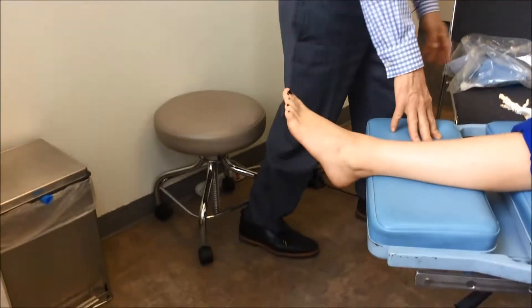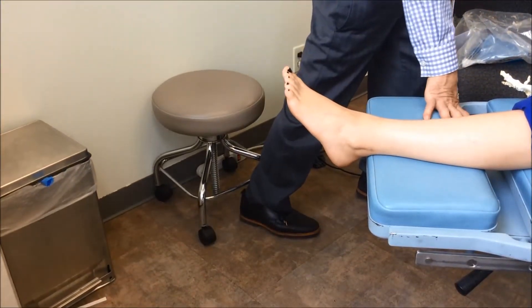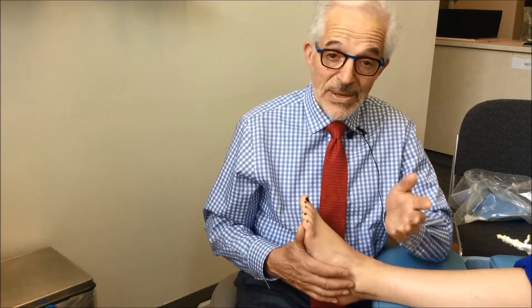While people can stand against the wall to stretch the calf out, leaning forward is one way to stretch the back of your calf. The problem is that in order to have an effective stretching program, we need to stretch 20 to 30 minutes per day on each extremity that has tightness of the calf. This just isn't practical by standing against a wall.